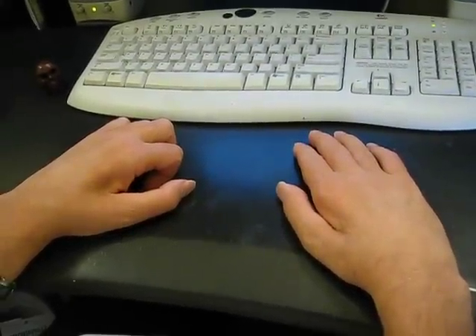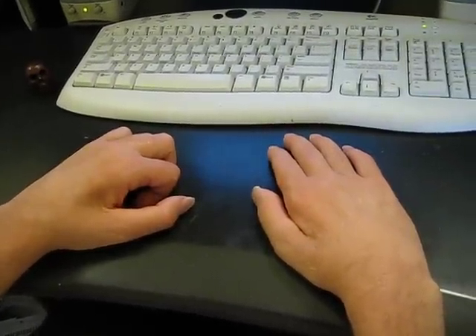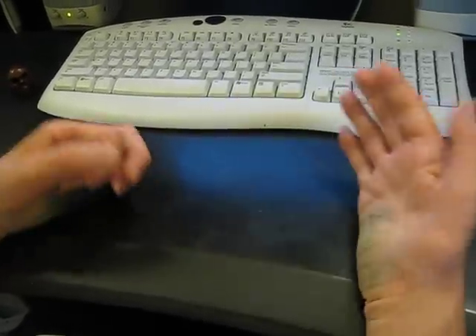You're a quadriplegic and your hands are paralyzed like mine, and you want to know how to use a computer. A lot of people use a regular mouse and keyboard. I don't recommend using any more adaptive devices than you need to, but since I need them and I like to type and I type my work, I use two devices.